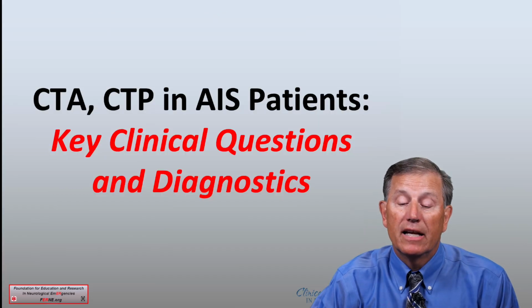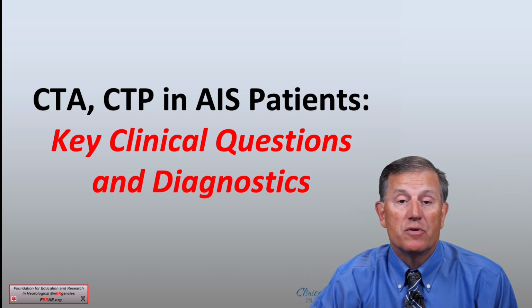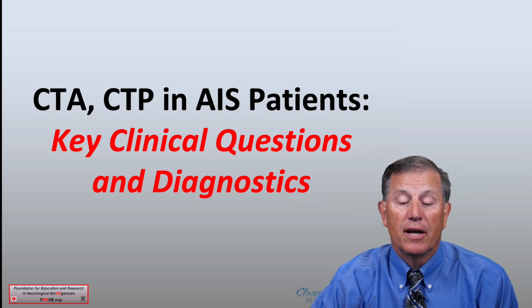What are the key clinical questions and diagnostics that will help to guide our thinking as we attempt to diagnose and treat stroke patients?